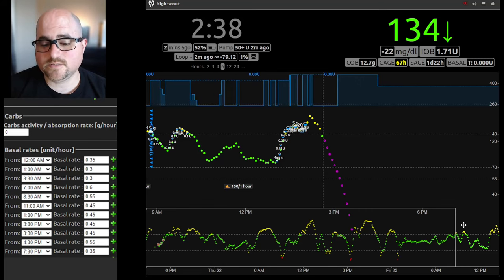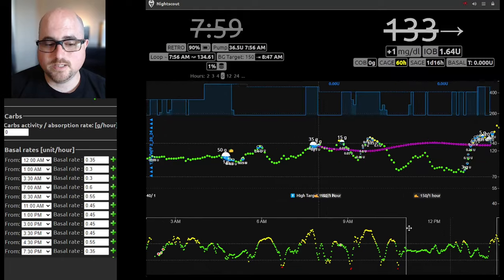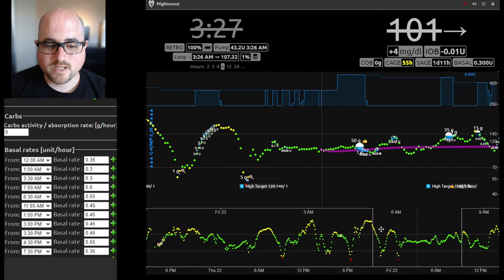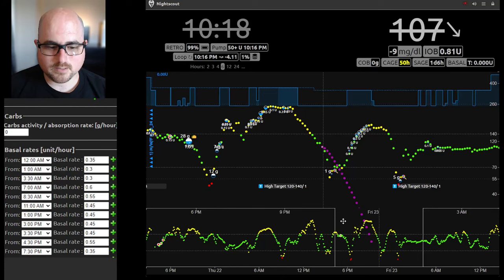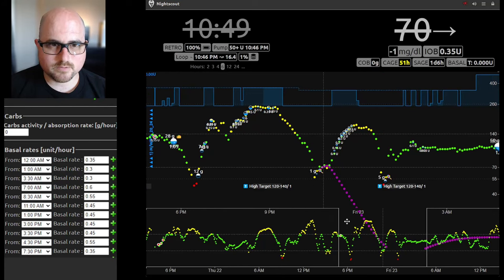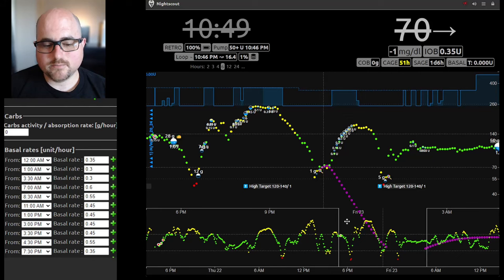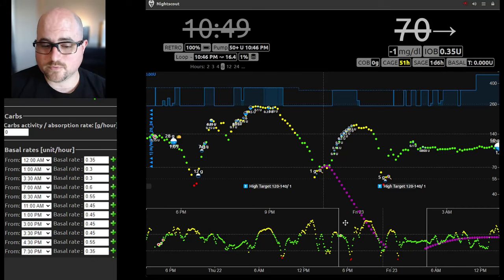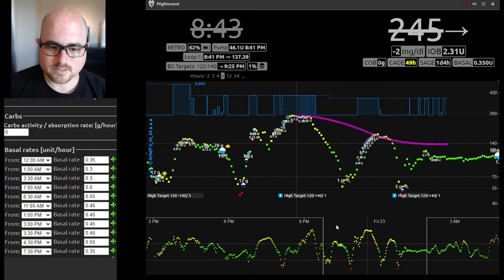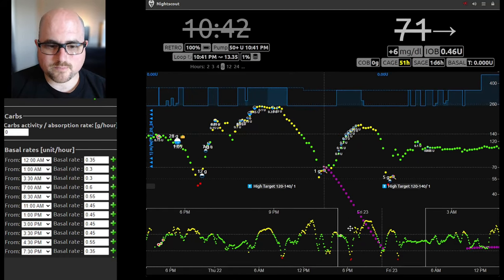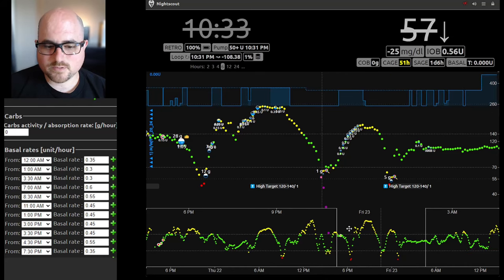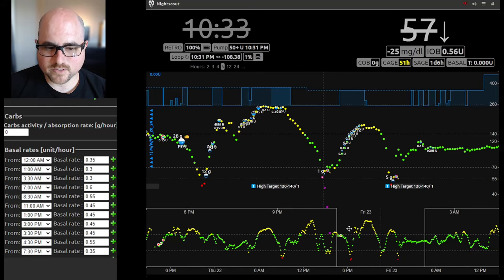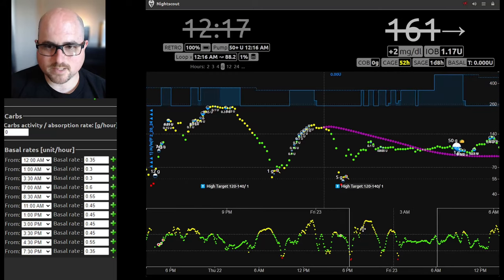The easiest thing to do is I always go look at the night, where you can avoid some of the food and whatnot, unless you're low-treating. Here is last night. Now Brandy, you guys are three hours ahead. Is that right? So what you see on my screen will be like 9 PM — it's actually midnight their time. That's kind of the way NightScout shows it, unless we look at the reports, which will show their actual time. When we get down here to the drop, we don't get any negative insulin on board, which would be nice to see if that meant the basal was too strong or not. But let's go back down to this one here.